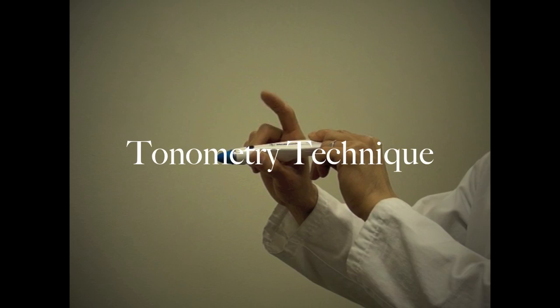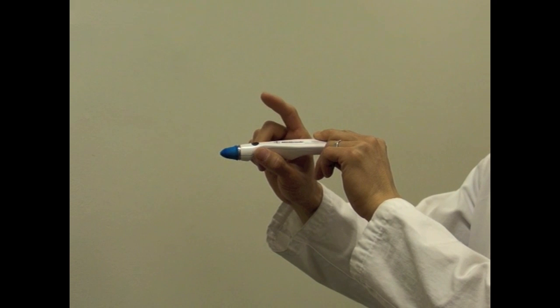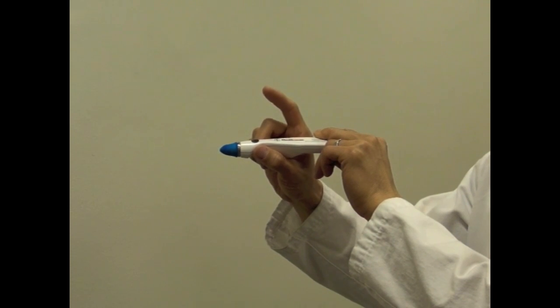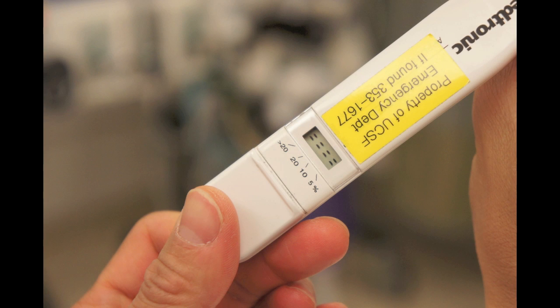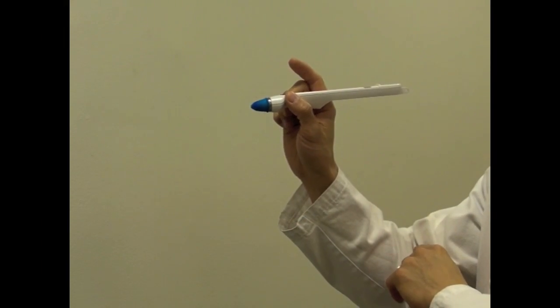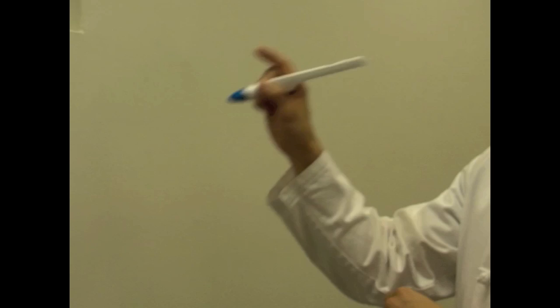Hold the tonometer between your thumb and your middle finger, leaving your index finger available to press the button. Push the black button to activate the tonometer. A double dashed line indicates that the device is ready to take measurements. Do NOT jab the patient's eye with the tonometer using your elbow — that's too much force.